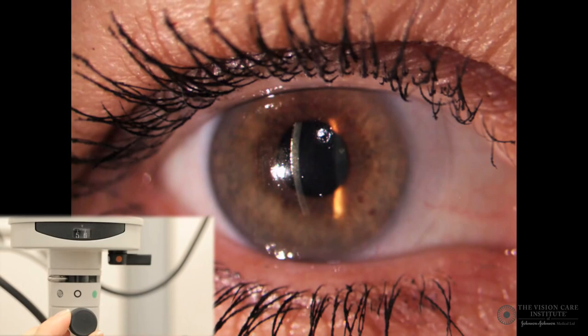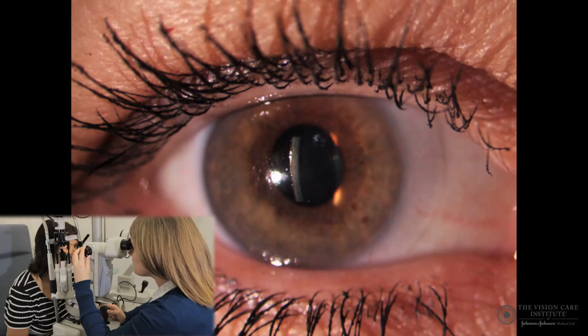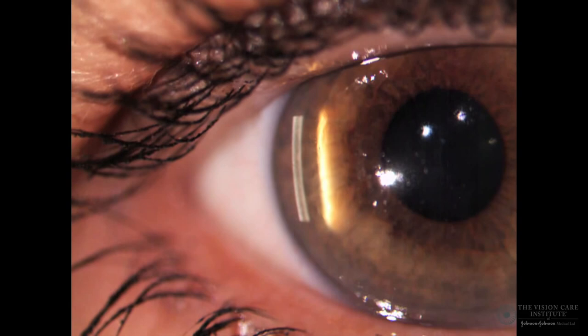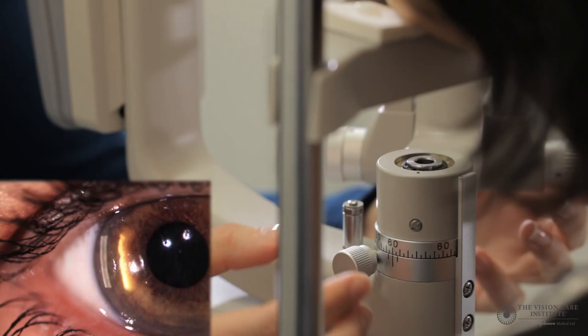Now that we have a clear short corneal section, we move the section over to the temporal part of the cornea as shown here. When we have this clearly in focus, it is important to have the angle between the illumination and observation systems at exactly 60 degrees. In order to ensure that this angle is maintained, we can lock the illumination system so that it always remains at 60 degrees.